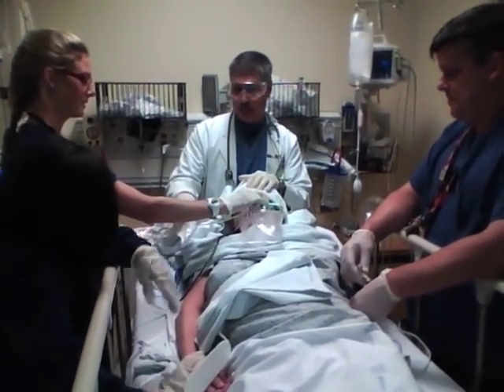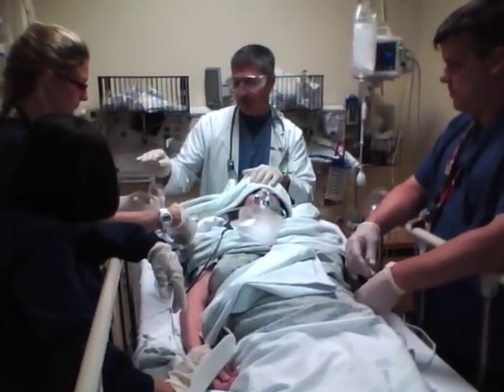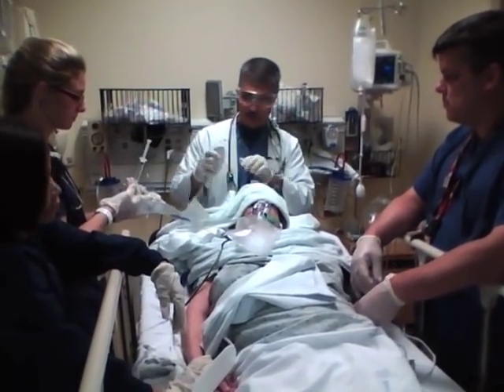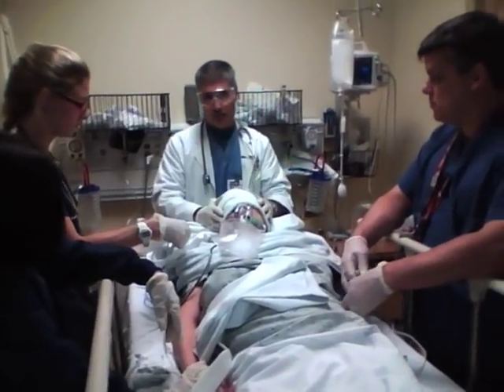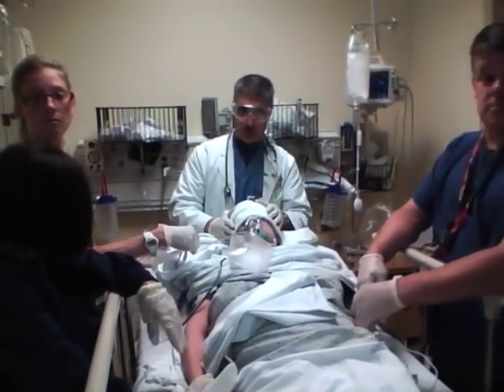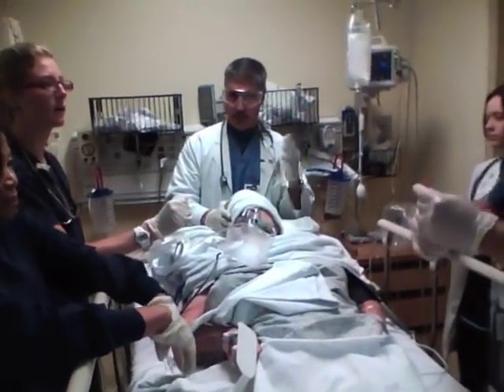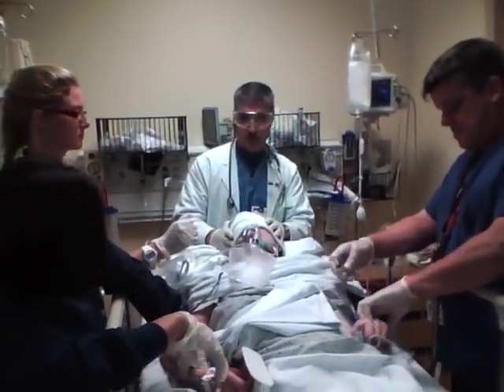We've got the endotracheal tube prepared — it's got a 10cc syringe on it so we can inflate the balloon — and we've got our laryngoscope already set up and the light checked. We're going to do her with rocuronium and ketamine. When you use rocuronium, it's the opposite of what a lot of people think: we push the rocuronium first, which is the paralytic, wait 15 seconds, and then push the sedative agent. In her case, we're using ketamine because her blood pressure is a little on the low side.